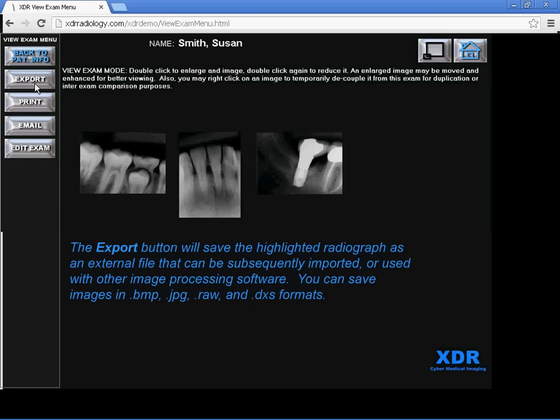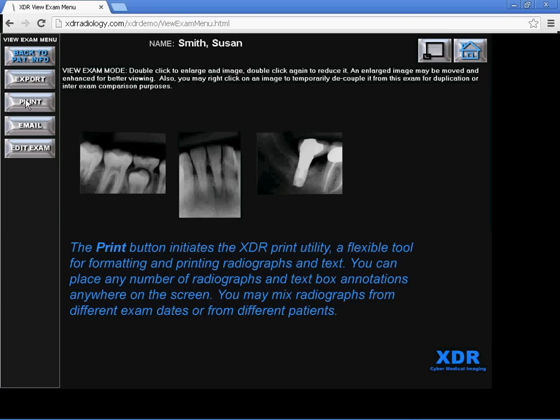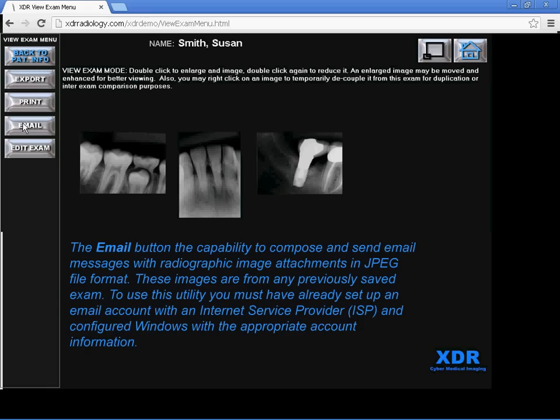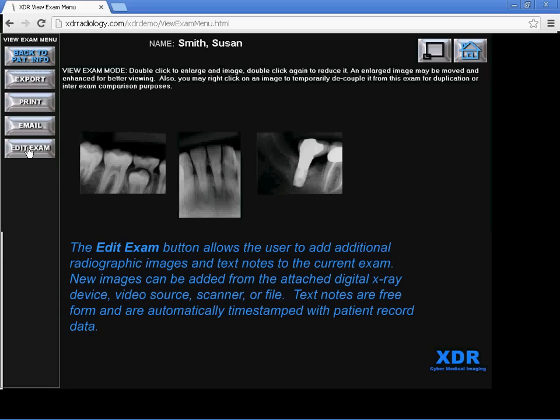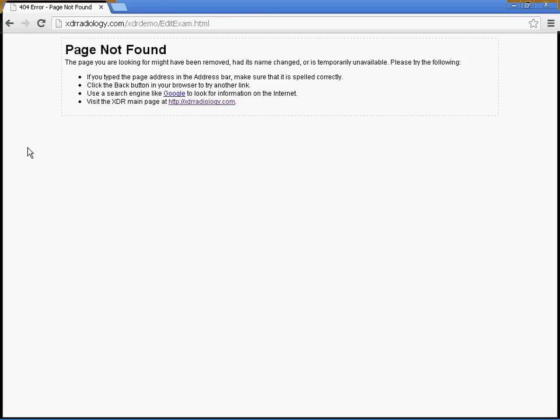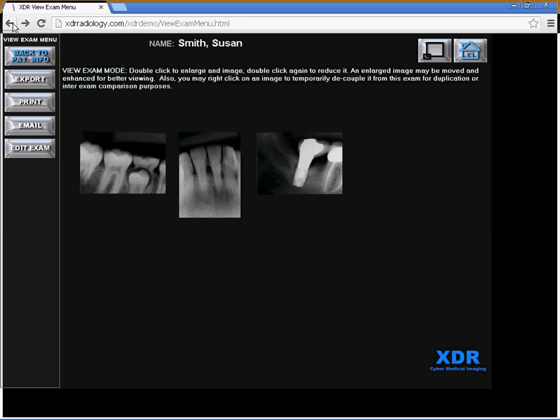You can also export radiographs, print them, email them, and edit the basic exam. If you click on Edit Exam you'll be able to perform various editing functions as well.